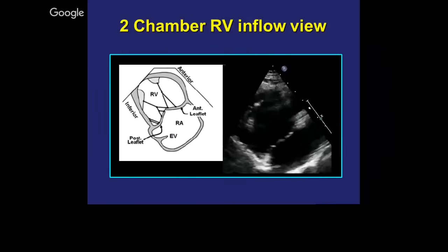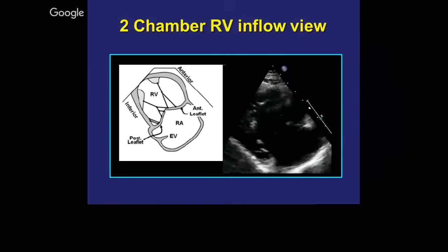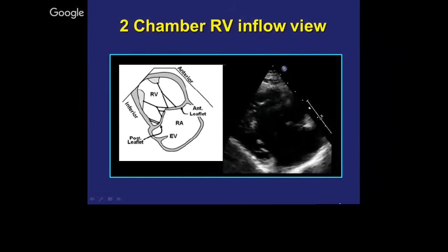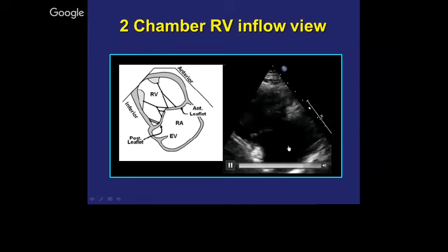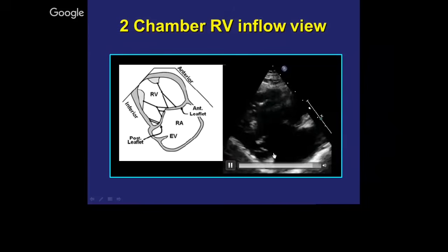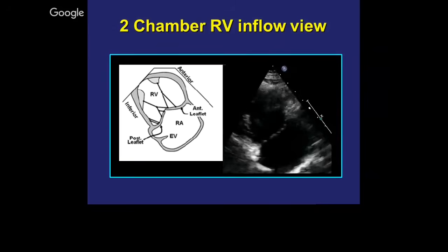This is what we call the right ventricle inflow view, because you can see the inflow of the tricuspid valve — the previous one was the outflow view. This is the inflow with the tricuspid valve at the base of the screen. That's your tricuspid valve, and of course this is the right atrium and this is the right ventricle. Sometimes you might see a prominent eustachian valve, which is more prominent when we're doing a transesophageal echocardiogram.